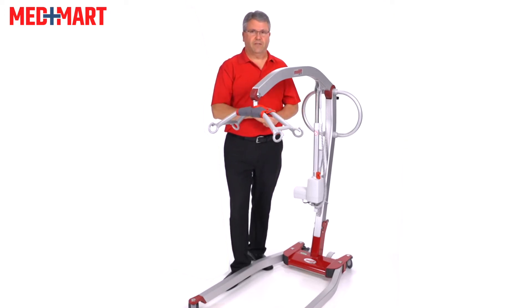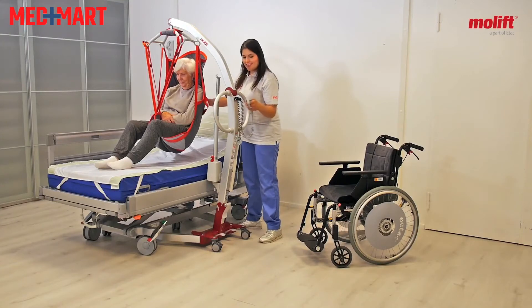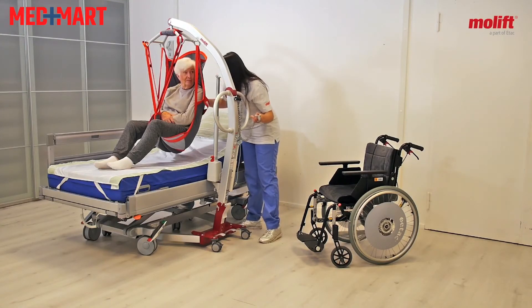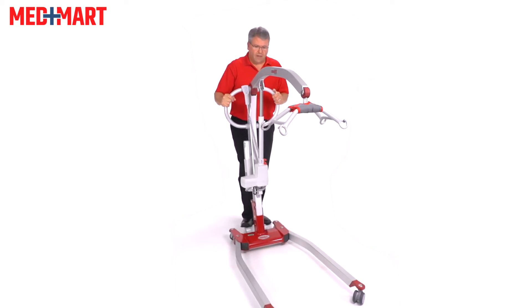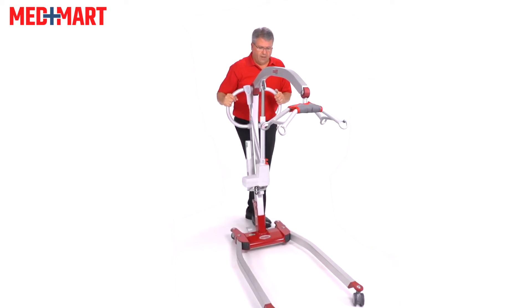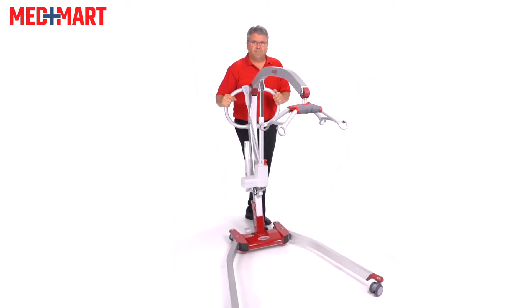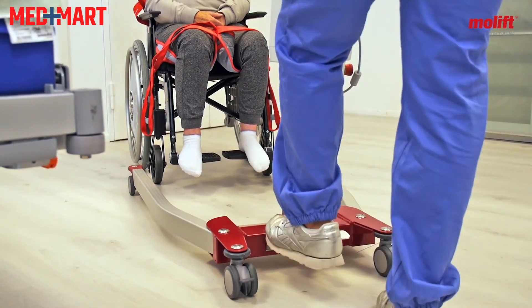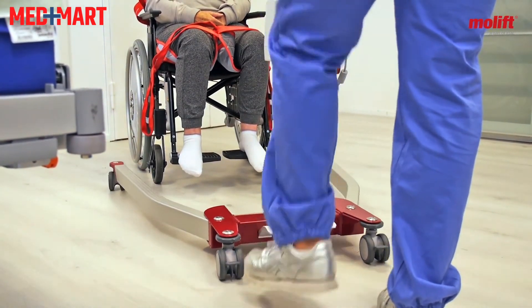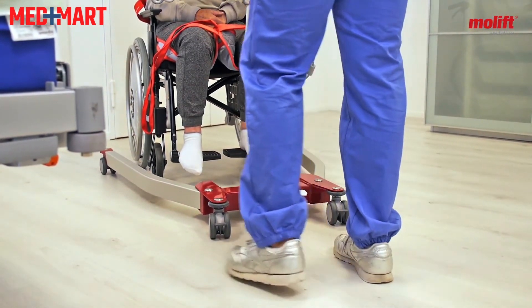One of the most unique things about this lift is it's almost like a ratchet system when you go to open the legs. Instead of having to do the entire motion at one time, it uses small incremental ratchet steps to open the legs, which makes it really easy to maneuver around a toilet, a lift chair, someone's wheelchair, or around the patient.